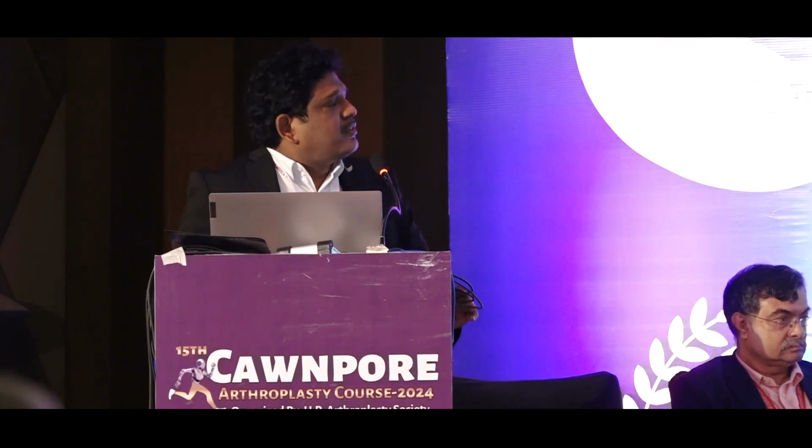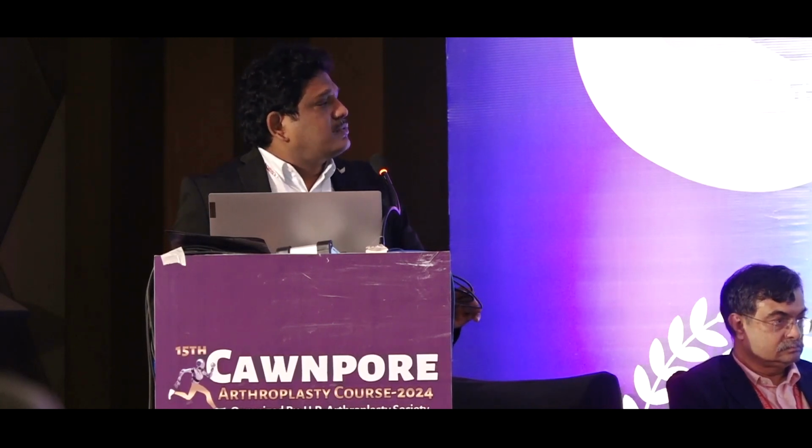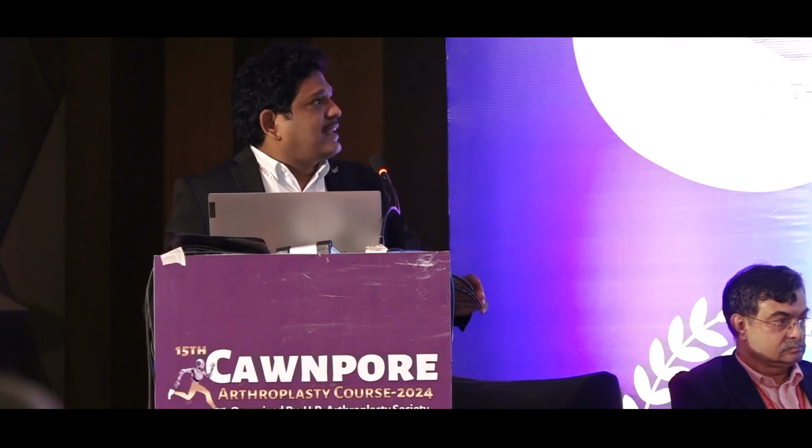This whole process of release of soft tissues and flexing the knee should be done very gently. One may need to do a quadriceps V-Y lengthening or snip of the quadriceps to evert the patella. Sometimes, because of tightness of the quadriceps mechanism, a tibial tuberosity osteotomy may also be required so that one can evert the patella and flex the knee.